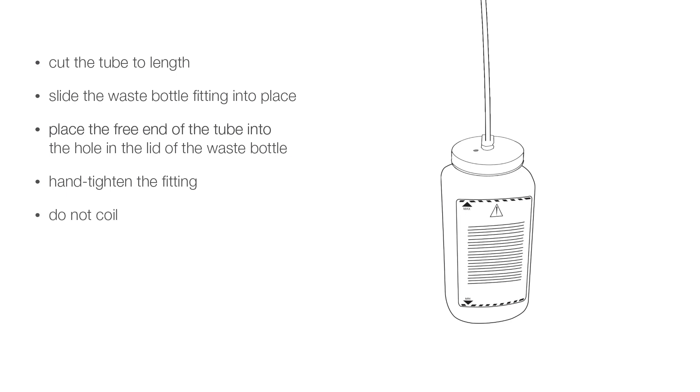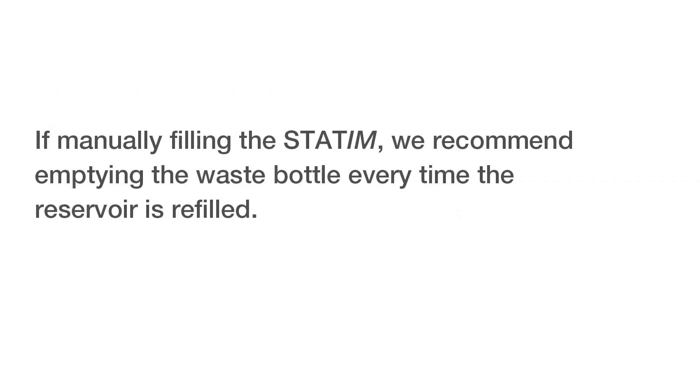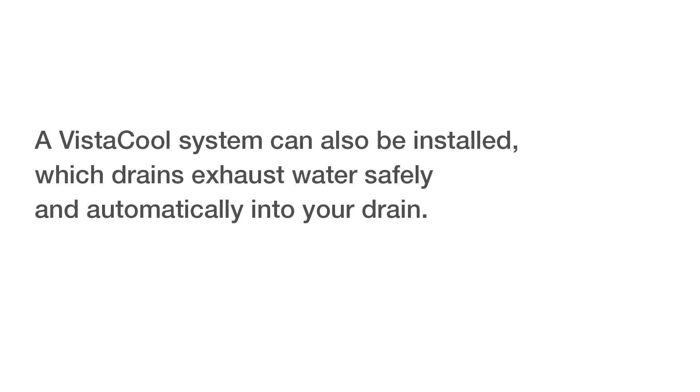Do not coil or kink the exhaust tube. Fill the waste bottle with water to the minimum level and place it near the unit, ensuring the bottle is stored below the unit. If manually filling the STATUM, we recommend emptying the waste bottle every time the reservoir is refilled. A VISTA-Cool system can also be installed, which drains exhaust water safely and automatically into your drain.